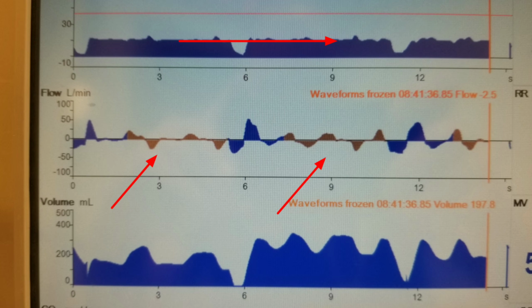But it's definitely a mode that encourages spontaneous ventilation. The minute that you are intubated, we should be concentrating on getting this patient extubated as soon as possible. So correction of the FRC, facilitating work of breathing, and an early start to spontaneous ventilation, spontaneous breathing, and encouragement. And they should be able to breathe relatively quickly, even if they have a pathology, even if they're fairly critically ill. Still, if they're able to breathe spontaneously with a decent work of breathing, this should still be an option, all right?